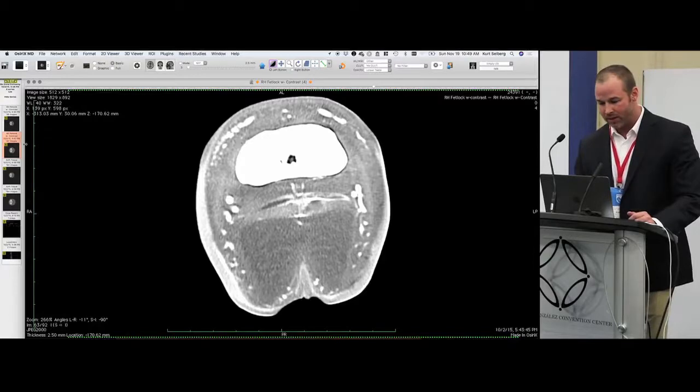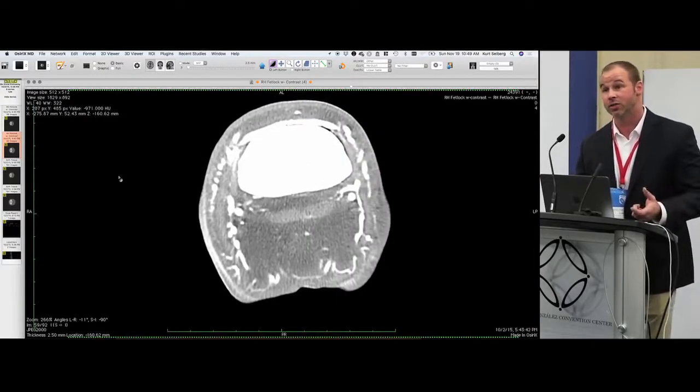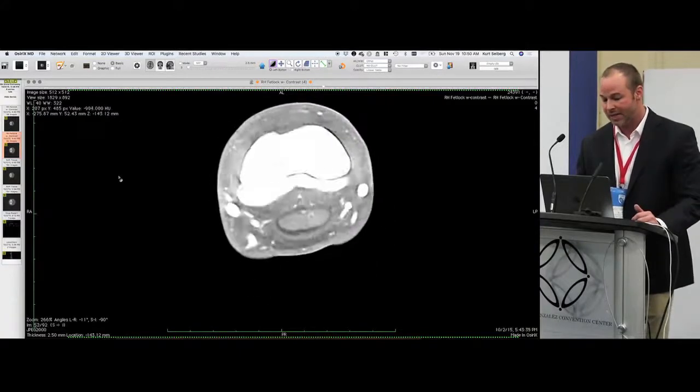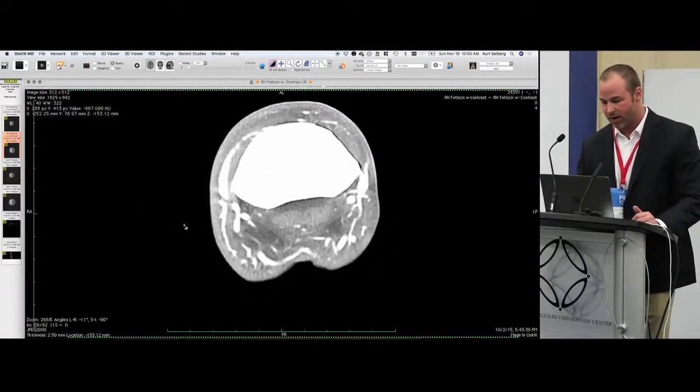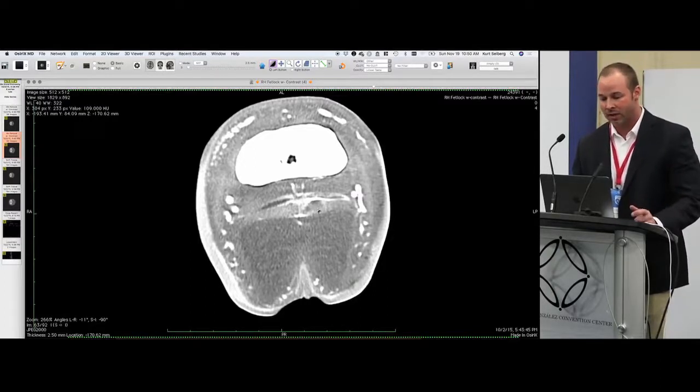And that is important because if you're going to use this and you don't have another technology to look at our soft tissues, let's say MRI, or it's in an area that is not seen by ultrasound, and CT is the technology that you have, then your arterial phase contrast is going to be very helpful to rim around the areas of tearing within the deep digital flexor tendon in areas that are difficult to see ultrasonographically. And we're just not going to be able to see that well. We've tried several times with our cone beam CT to look at those areas with intra-arterial contrast in some futile nature.